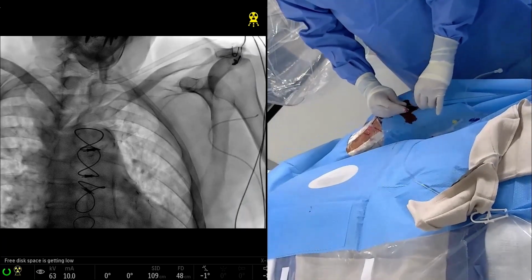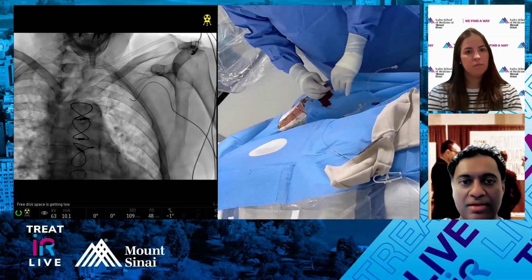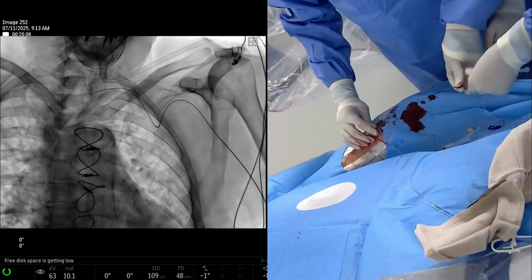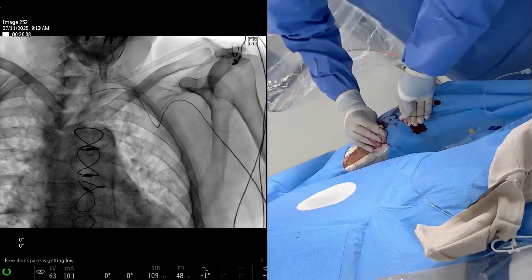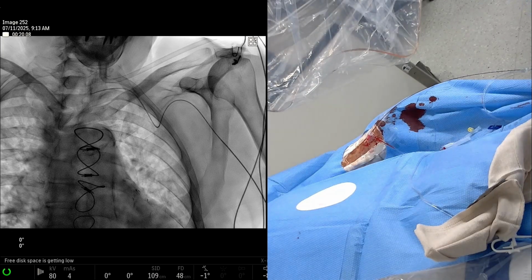And do you pre-op cross-sectional imaging of the arch and subclavian? Yeah, we looked at it. We're going to switch this out for this. I'm just going to take this Simmons. We look at the arch, just make sure there's no disease, especially if we have imaging. We're not typically getting pre-op imaging of the chest on these patients. We haven't really run into issues. Obviously, we'll look at blood pressure and such. He has a booming radial pulse, so I'm not really worried about a subclavian stenosis or something like that. That's how we do it.